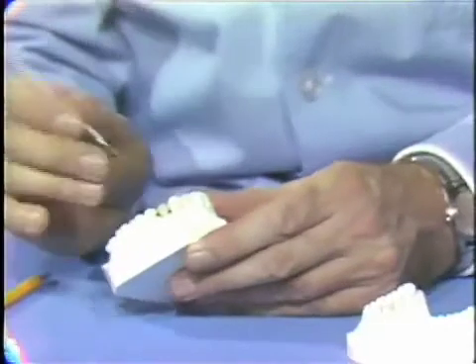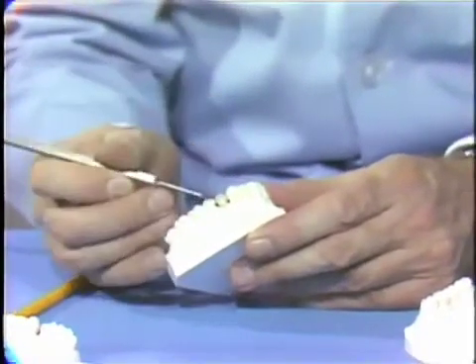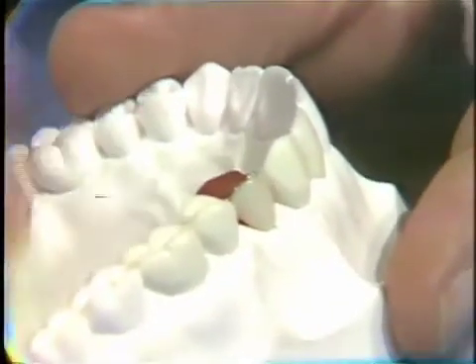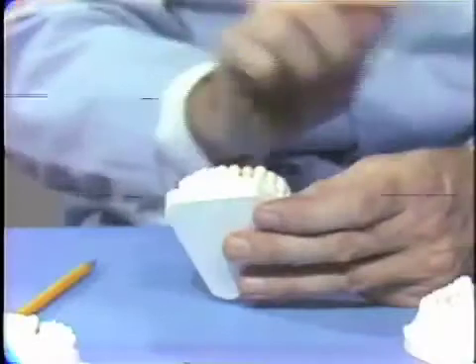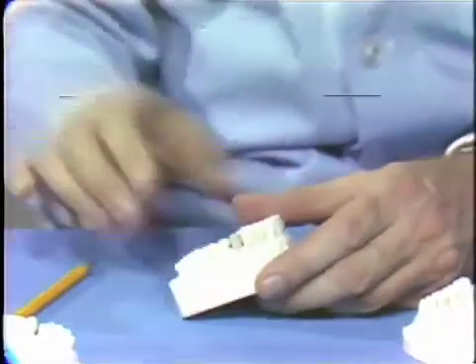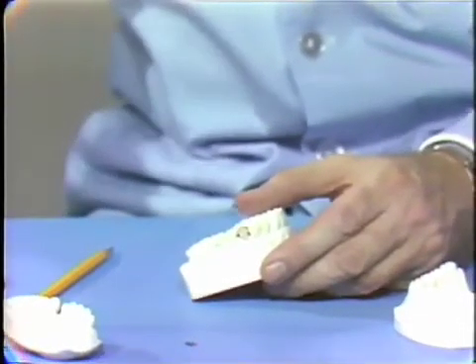And then when you've found that position, we're going to make a plaster template to go on this side, which will hold this in position whilst the occlusal is waxed up, so that we can develop the occlusal surface in relation to the opposing teeth and maintain that. So our next step then is to make a plaster template for this situation.